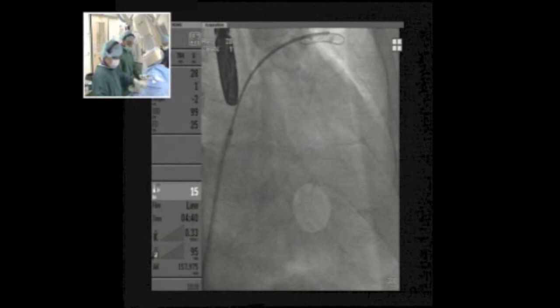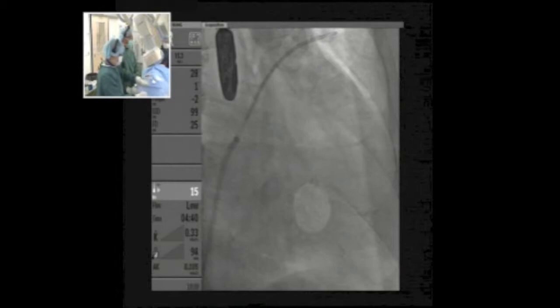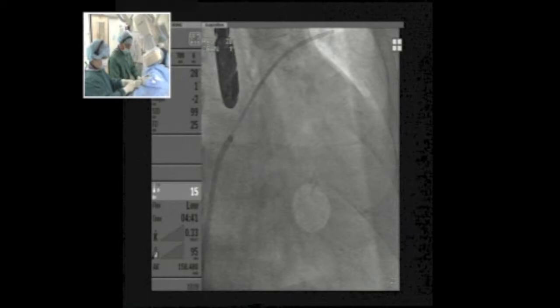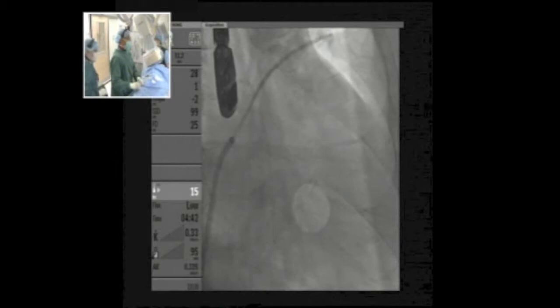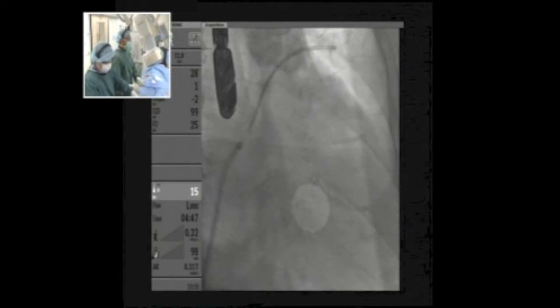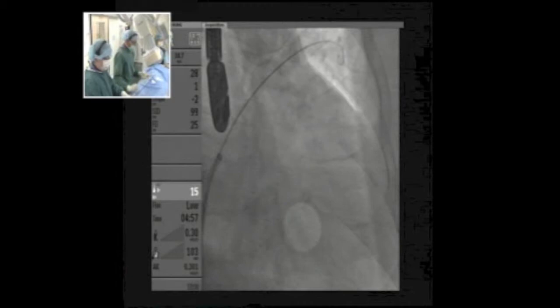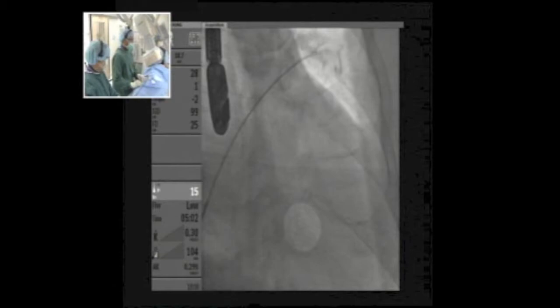We now need a stiff wire. We are in the pulmonary vein with the multipurpose catheter. I will remove the regular guide wire and replace it with the stiff one — an Amplatz Super Stiff guide wire. We will then remove the multipurpose catheter and the SL1 sheath to place the delivery sheath.